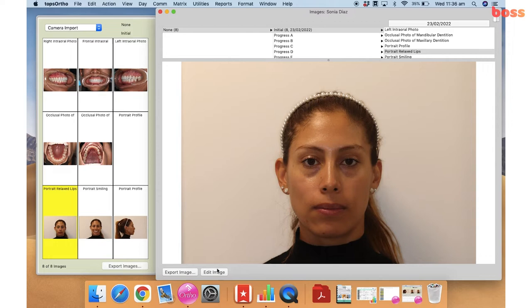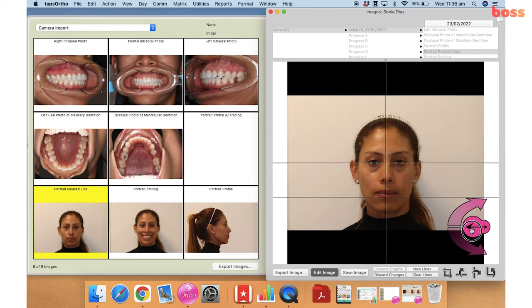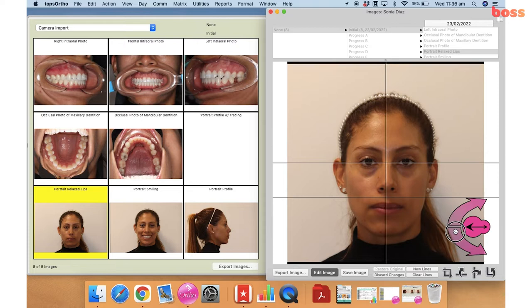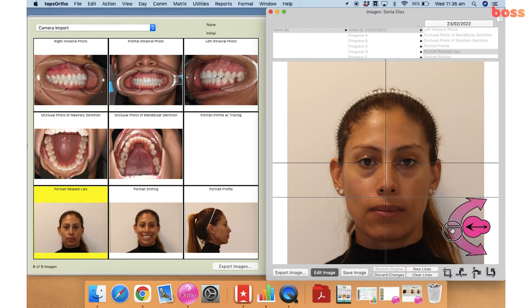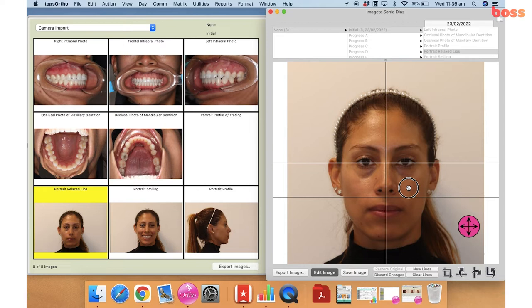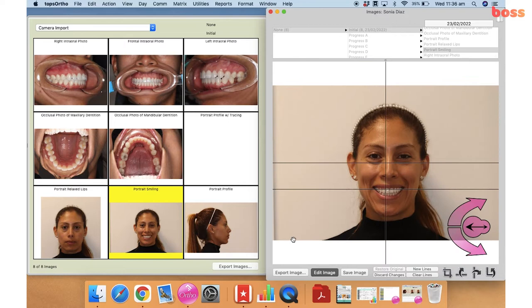We're going to start with the portrait with the relaxed lips for our extraoral shots. When we edit the image we like to square it first and then zoom in. As you can see, both ears are equally projected and we're zooming in enough that our line is running across both eyes as well. I'm just going to adjust this so that the nose is in the center of the photograph, and then we'll save this one.